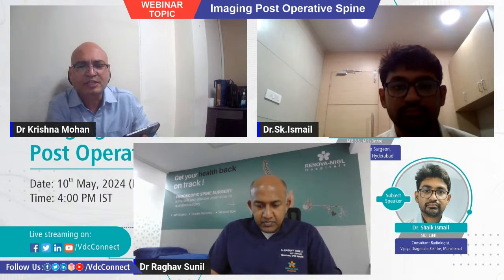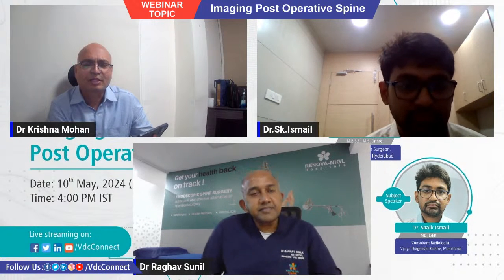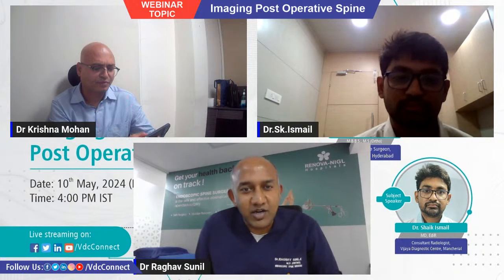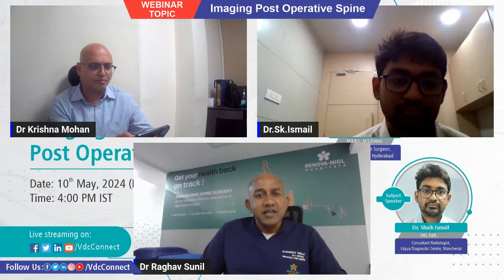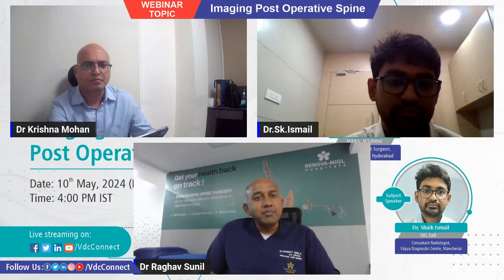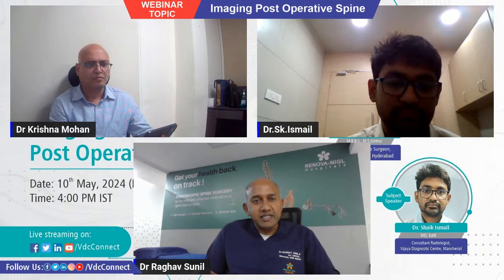Yeah, Raghav, we can start again. So what are the things you expect from the radiologist? When we were training, we were always taught not to do a post-op MRI after a discectomy, because there were a lot of doubtful shadows, and it is very difficult to justify doing a regular post-op MRI unless there is some sort of complication.